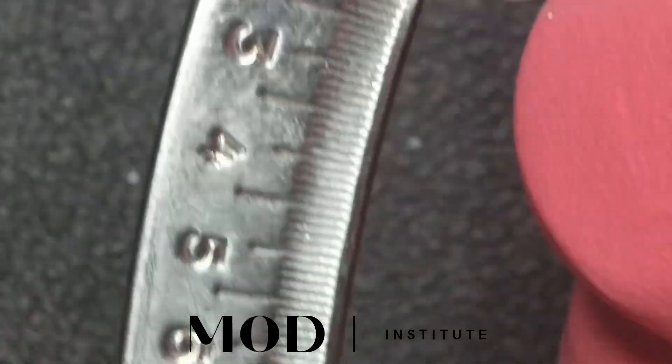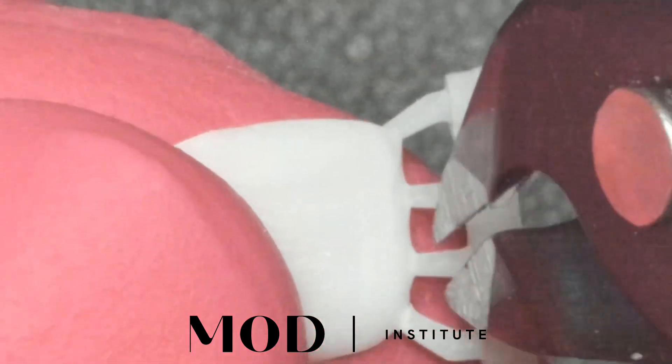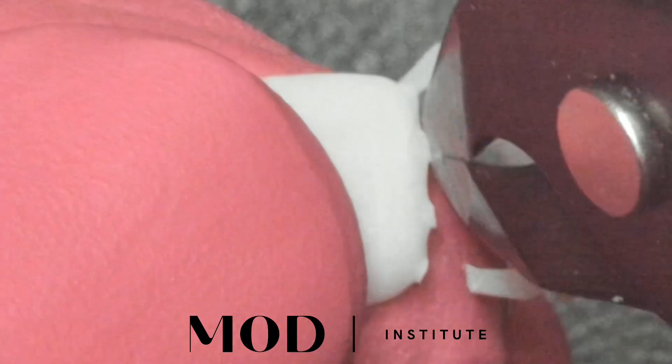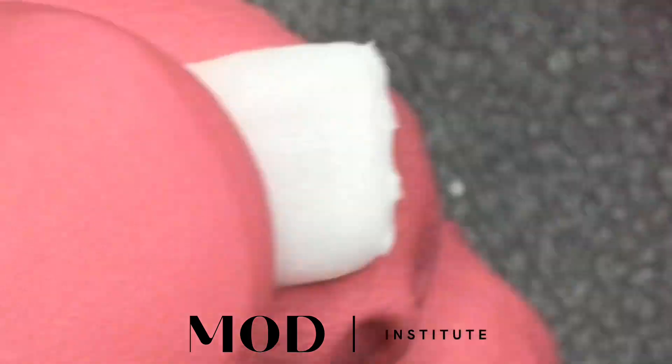Here we have a print off of the Sprint Ray and it's right about 300-400 microns right off the bat. The first thing I'm going to do is clip those little supports off and use this felt wheel from Comet to finish the little support bumps that are left.